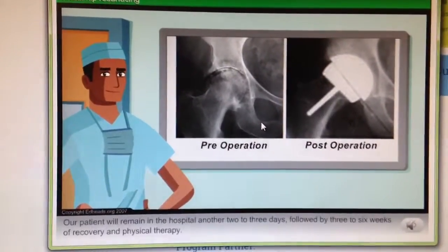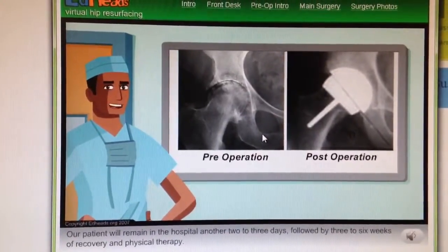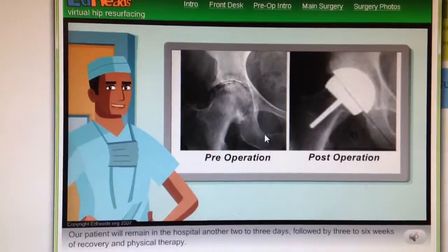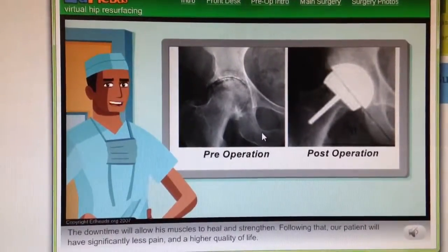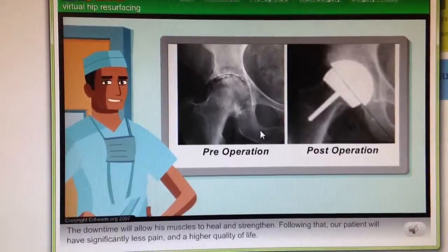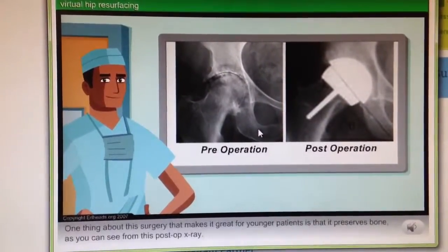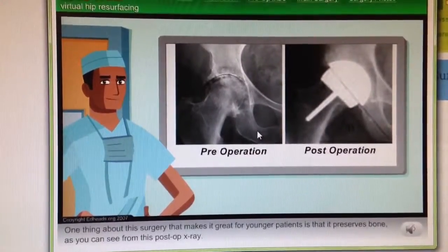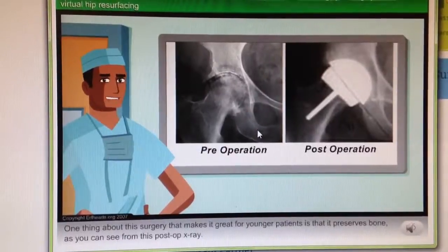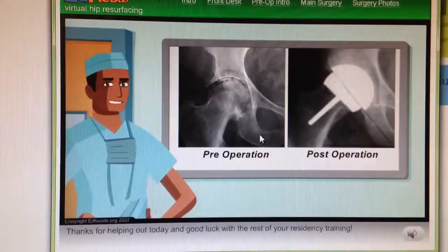The OR team will bandage the incision and move the patient to the recovery room. Our patient will remain in the hospital another two to three days, followed by three to six weeks of recovery and physical therapy. The downtime will allow his muscles to heal and strengthen. Following that, our patient will have significantly less pain and a higher quality of life. One thing about this surgery that makes it great for younger patients is that it preserves bone, as you can see from this post-op x-ray. Thanks for helping out today, and good luck with the rest of your residency training.